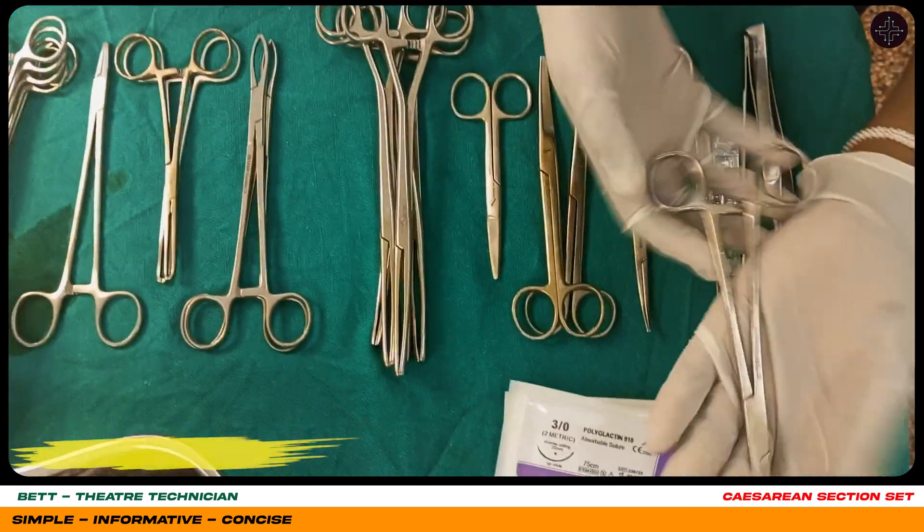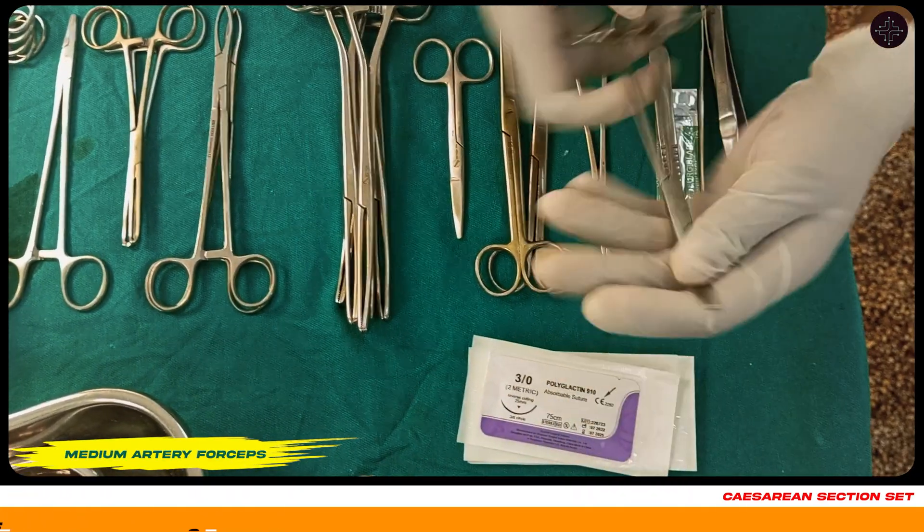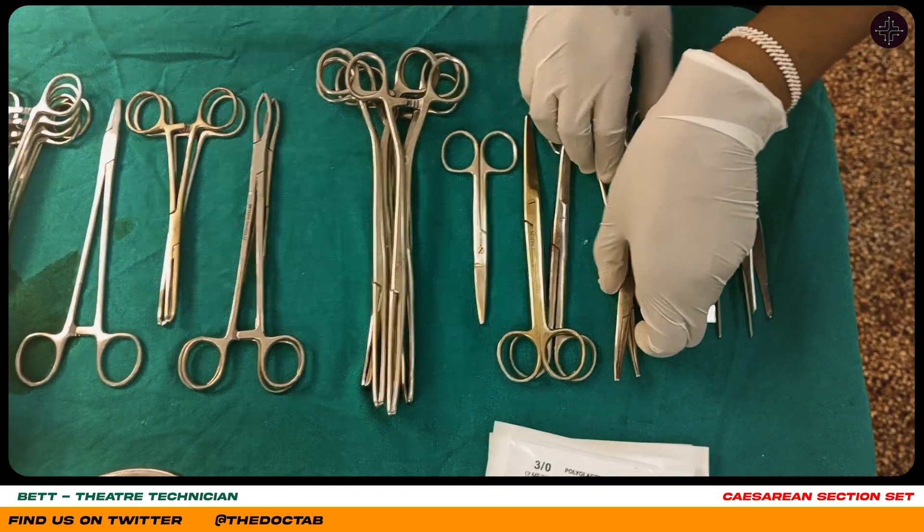Here we have a medium artery forceps, which is used for clamping the umbilical cord before cutting to prevent bleeding.